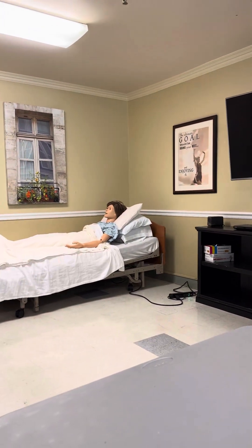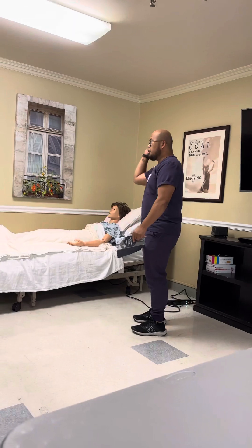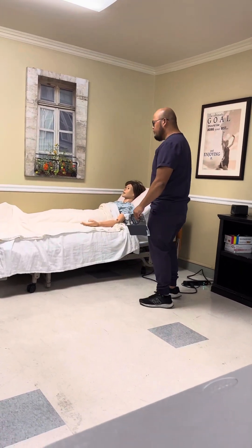I'm going to weigh you on that standing scale. Is that okay? The patient says yes. Check the name band for safety, post the curtain for privacy, and then lock the bed for safety.